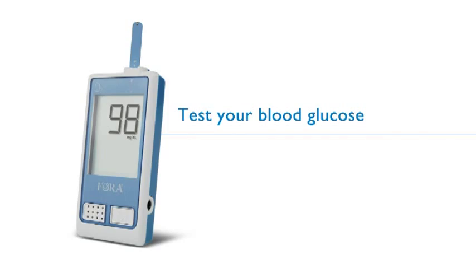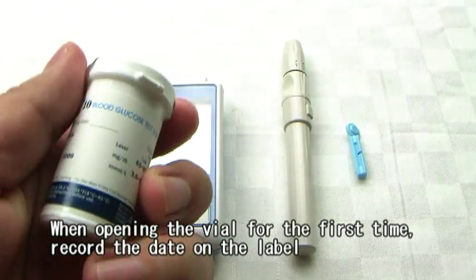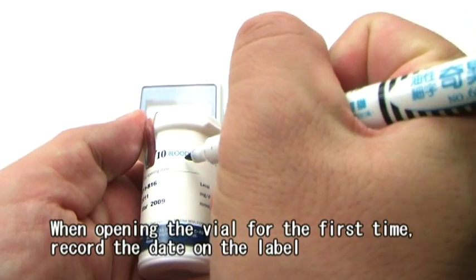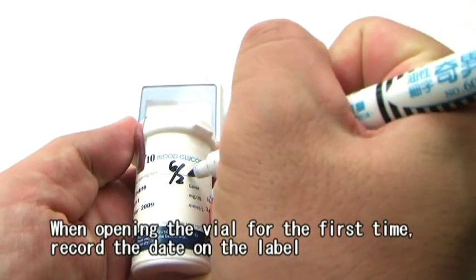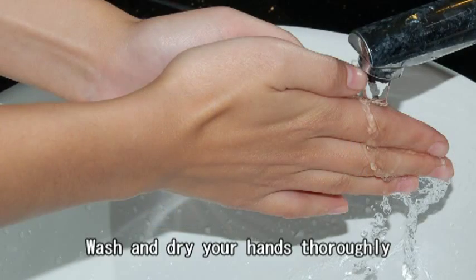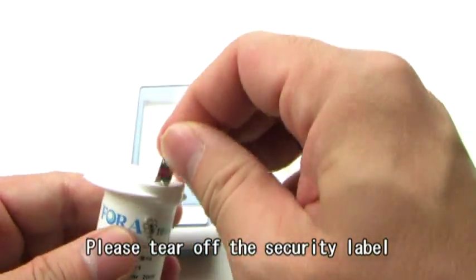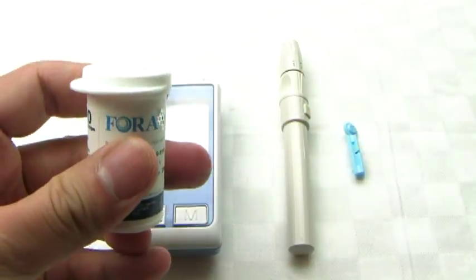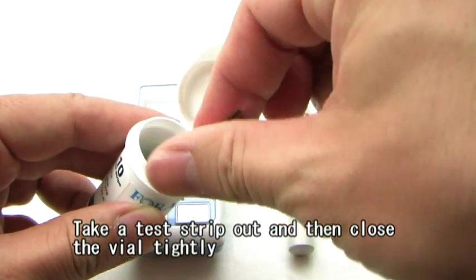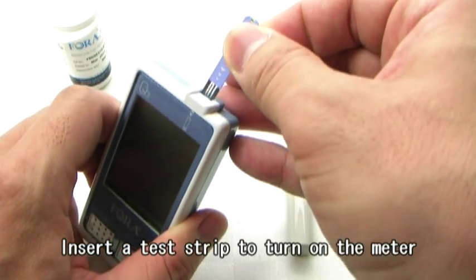Test your blood glucose. When opening the vial for the first time, record the date on the label. Wash and dry your hands thoroughly. Tear off the security label. Take a test strip out and close the vial tightly. Insert a test strip to turn on the meter.